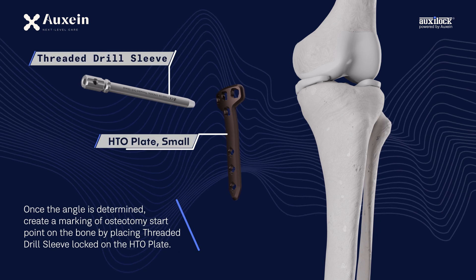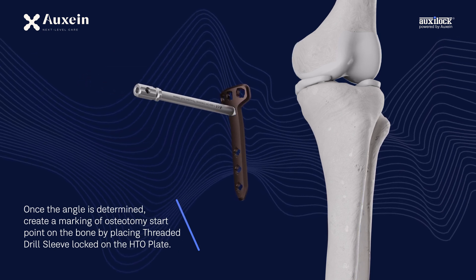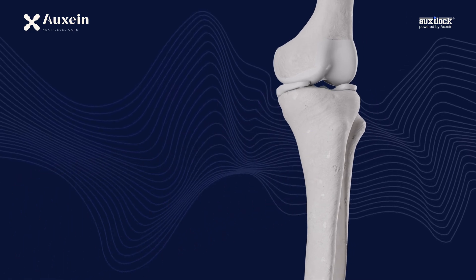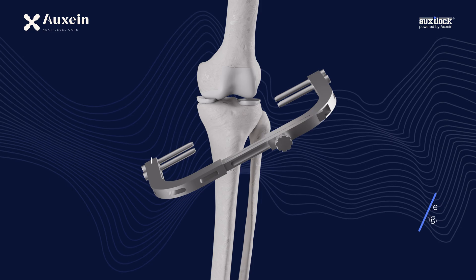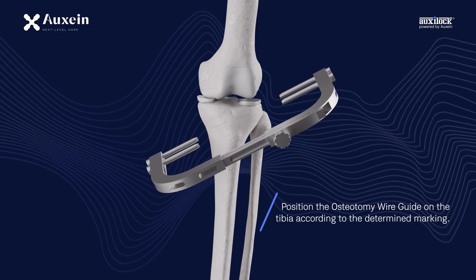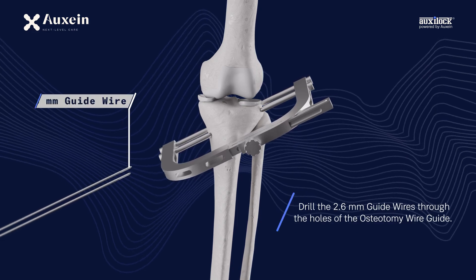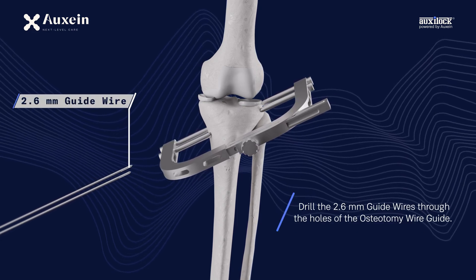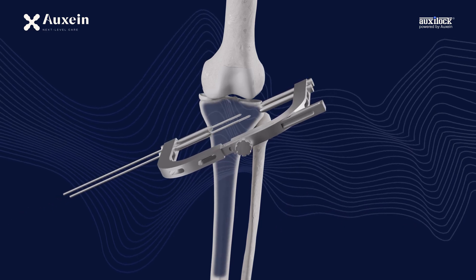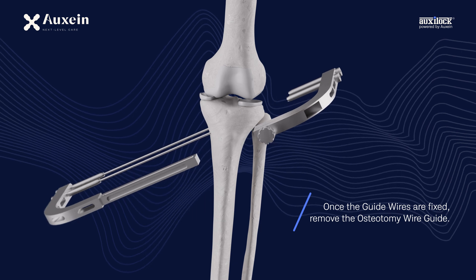Once the angle is determined, create a marking of osteotomy start point on the bone by placing the threaded drill sleeve locked on the HTO plate. Position the osteotomy wire guide on the tibia according to the determined marking. Drill the 2.6 mm guide wires through the holes of the osteotomy wire guide. Once the guide wires are fixed, remove the osteotomy wire guide.